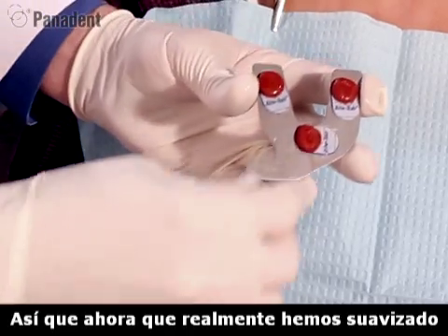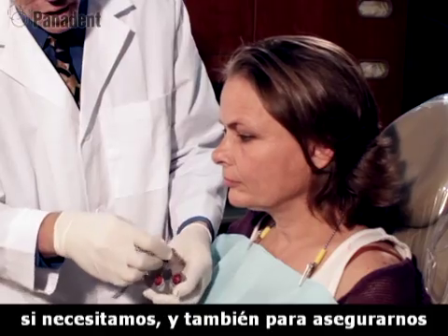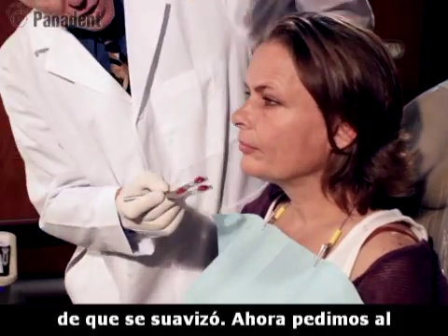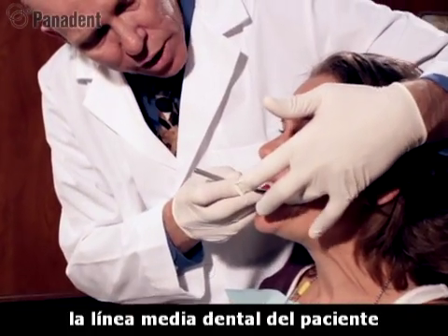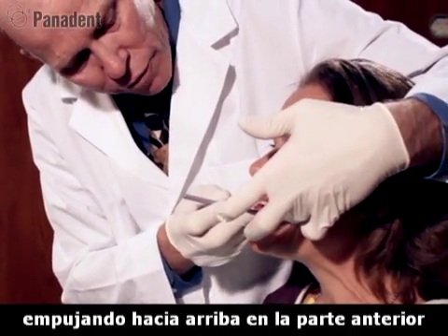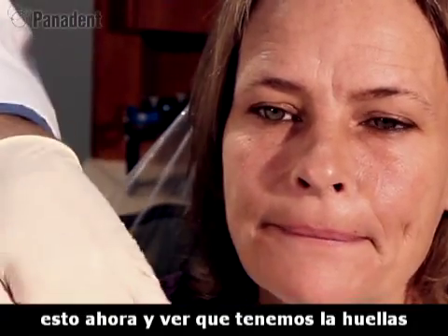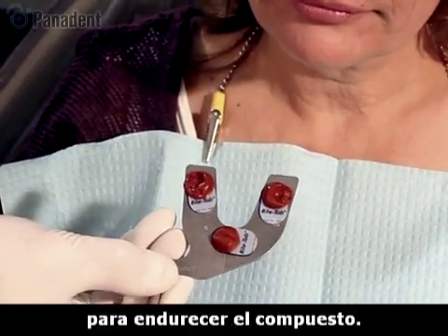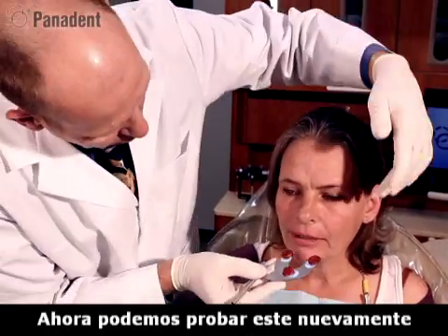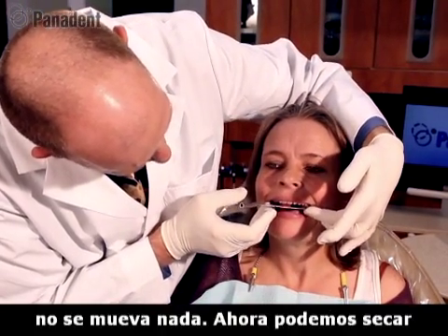Now we soften the compound in hot water. We can squeeze it a little bit into a cone shape if needed and make sure it's softened. We open the patient's mouth, place this in, align the dental midline with the patient's dental midline, pushing up in the front as well as in the back. Then we take it out and we can see indentations of both the molars and the incisors. We put this in cold water to harden the compound, then try it back in the patient's mouth to make sure we have a good fit — it doesn't rock or anything.